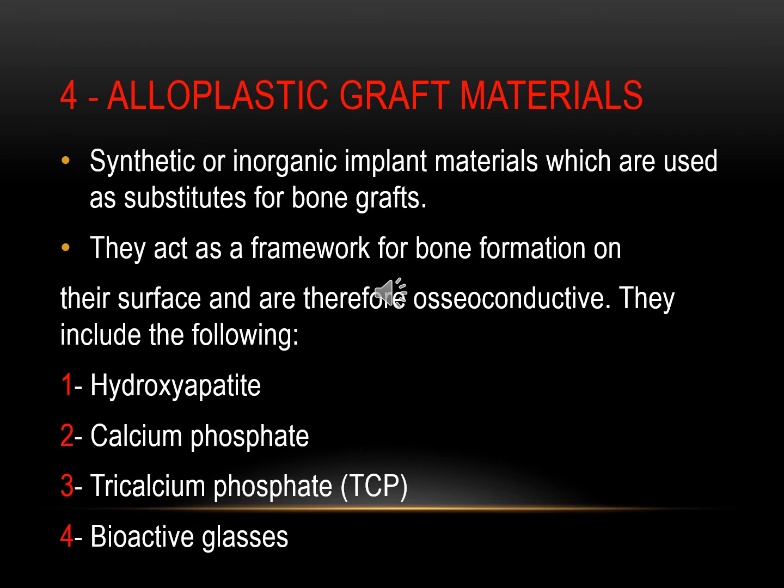The most important or the most famous types of this bone graft are hydroxyapatite, calcium phosphate, tricalcium phosphate TCP, or bioactive glasses.